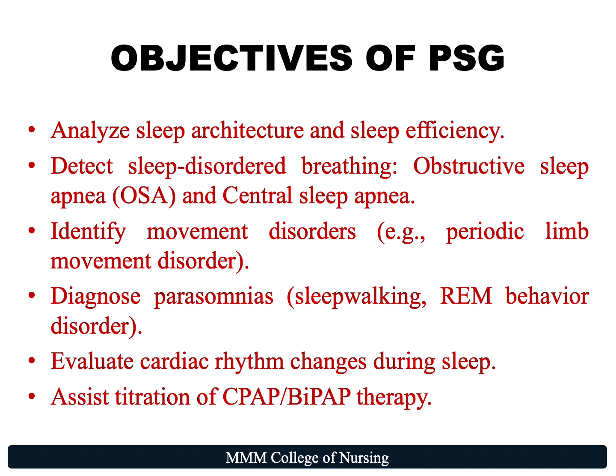PSG can also be used to diagnose parasomnias, which involves unusual behaviors like sleepwalking, talking, or acting out dreams during sleep transitions or deep sleep, including actions like night terrors, sleepwalking, sleep paralysis, and vivid nightmares, often with little memory of the event when the person wakes up.